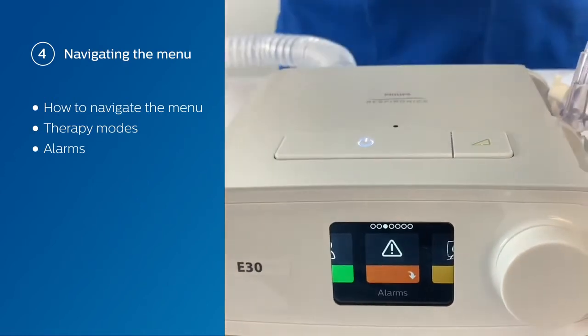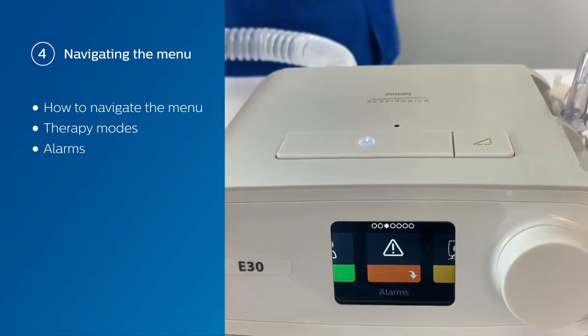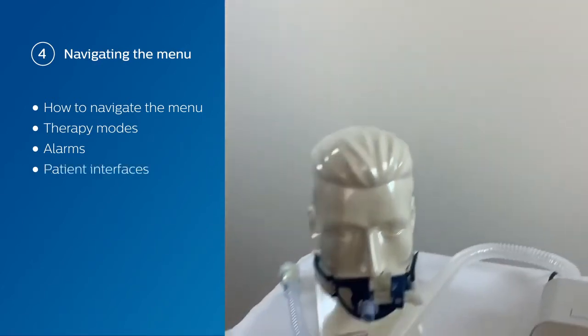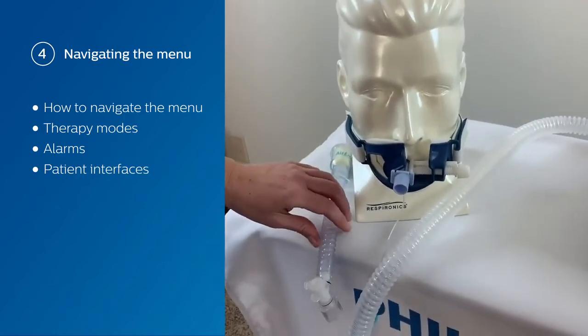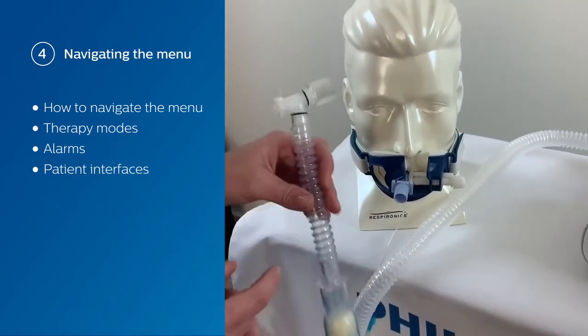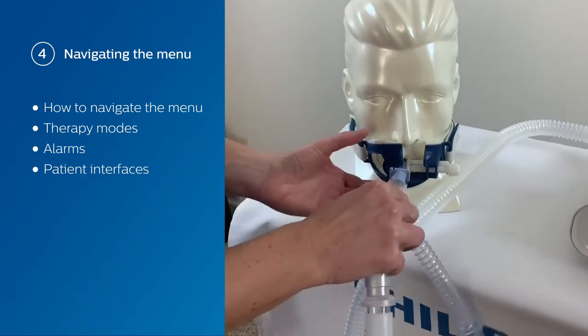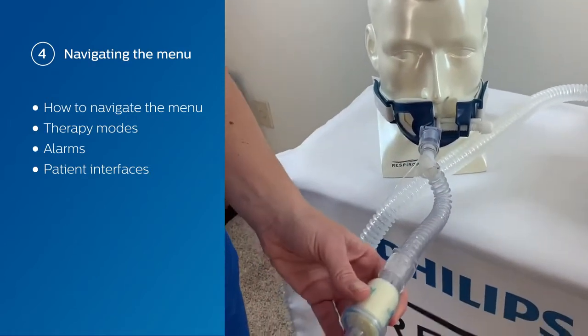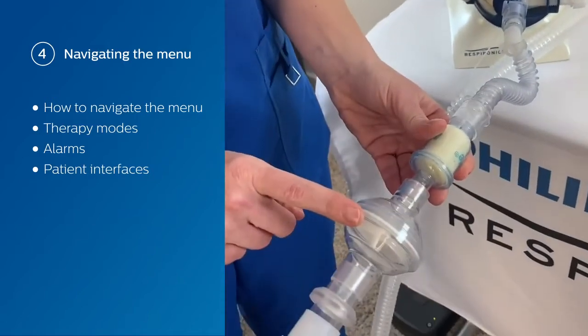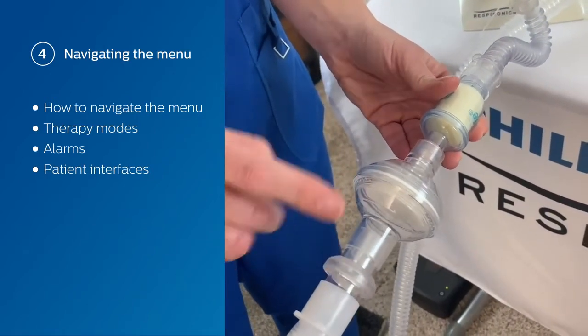We are ready to start therapy. Let's take a look at how we can set up the circuit with a number of different patient situations. In this case, we've got an intubated patient. We can connect a tracheostomy adapter with an HME, and that can connect easily to the circuit that we already have with our bacterial viral filter and our exhalation port.